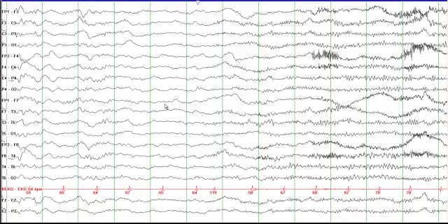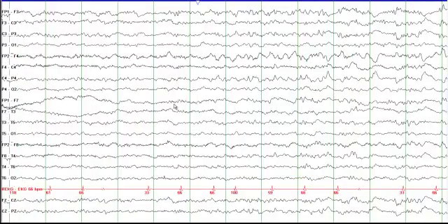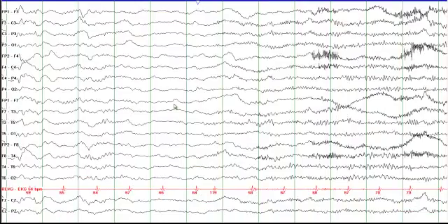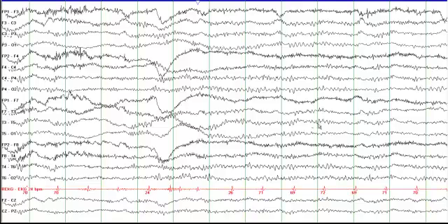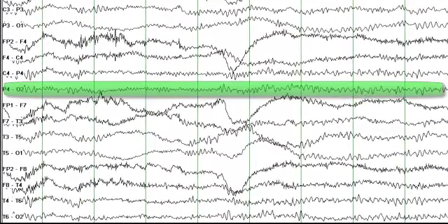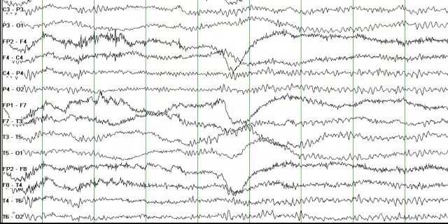That activity disappears and the alpha rhythm comes back. Going back — there is a beginning, there is an evolution, and there is a stop — so this qualifies for an electrographic seizure. It has a discrete beginning, a discrete ending, and then the alpha rhythm continues. Look at P4O2 and P3O1 — you can see the alpha rhythm in both.